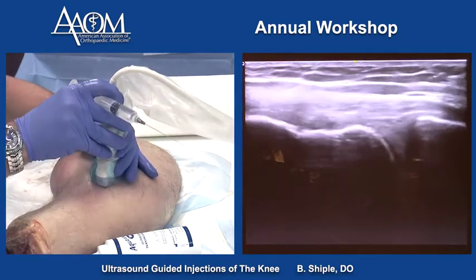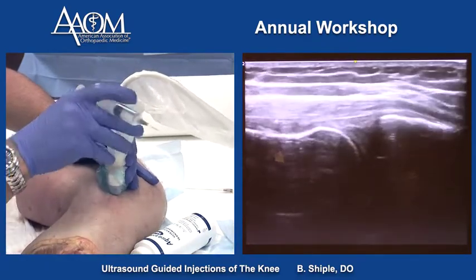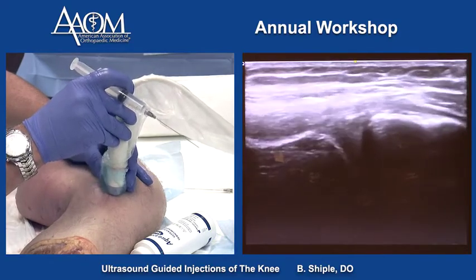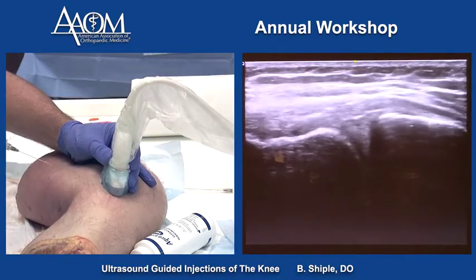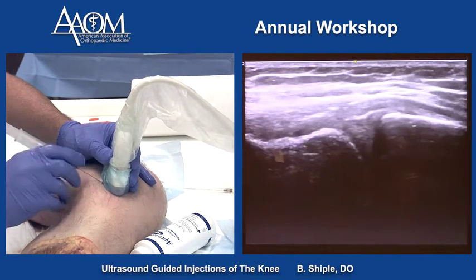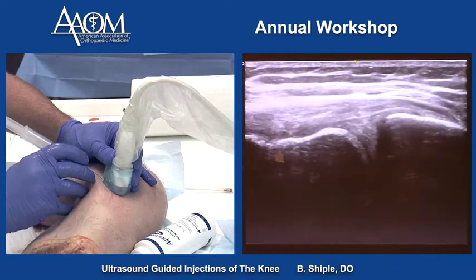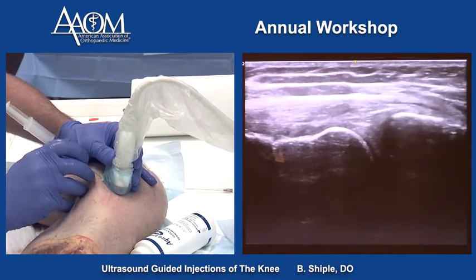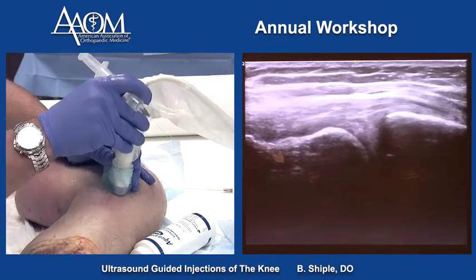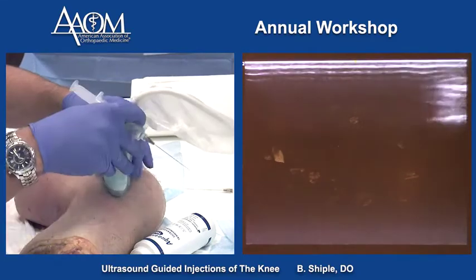If we wanted to inject the medial meniscus in short axis, put the coronary ligament and medial meniscus over the center of the screen as our target, and enter about a centimeter away from the probe in short axis. That's my needle right there, in the MCL-medial meniscus interface. This is a very healthy medial meniscus — it's kind of hard rubber to pass the needle through, unlike a beat-up medial meniscus, which is like injecting a sponge.